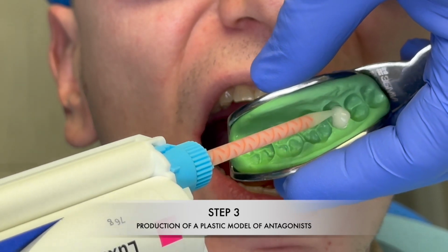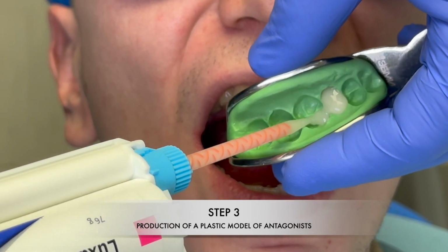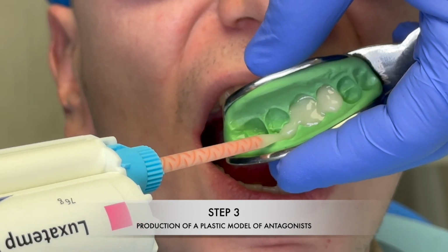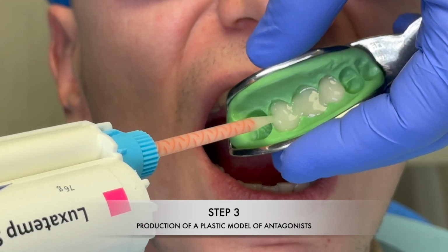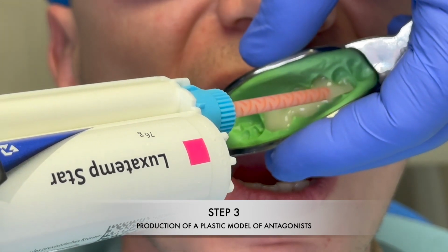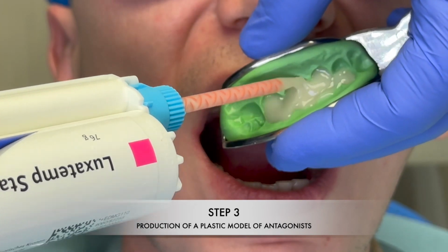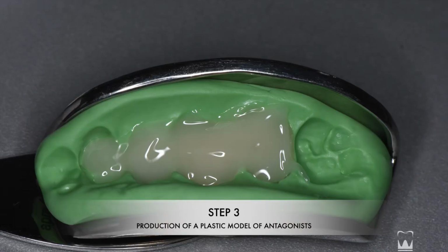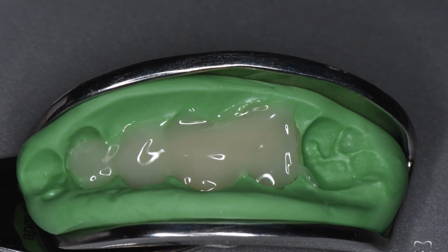Step 3. Making the plastic model of antagonist teeth. To do this, I use a quick hardening plastic which I put into a silicone impression. It is very important to keep the nozzle of the mixing gun constantly immersed in the plastic during the application of the material, to avoid the formation of air pores on the chewing surface of the antagonists.